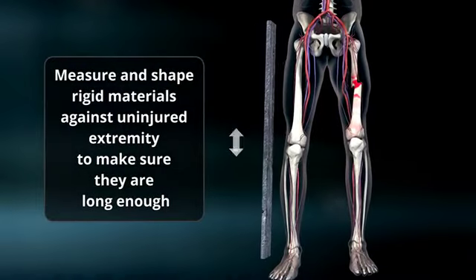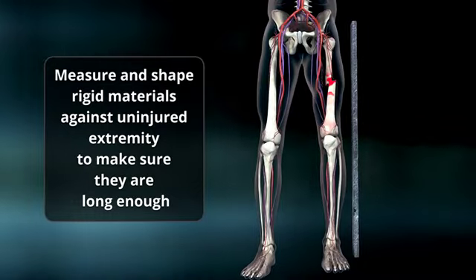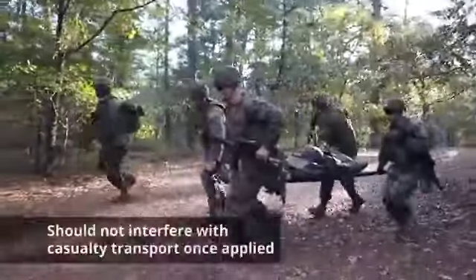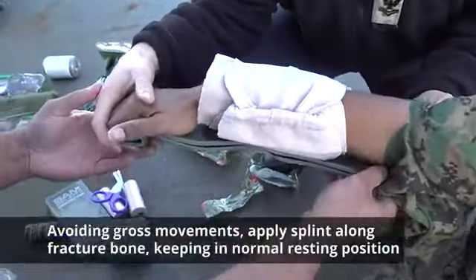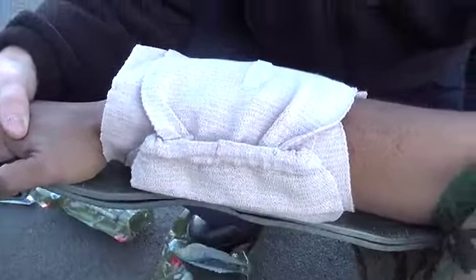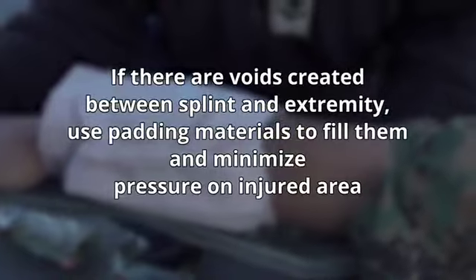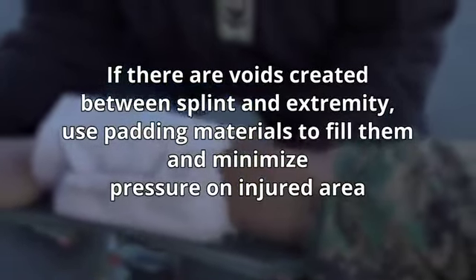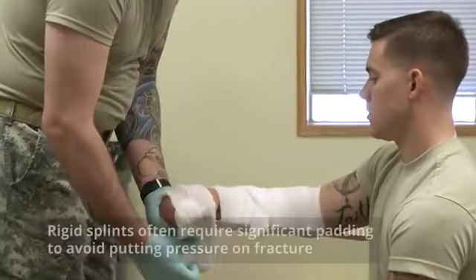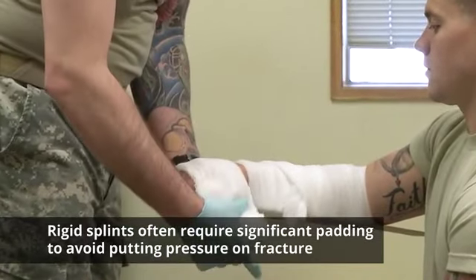If a malleable splint isn't available, then measure and shape rigid materials against the uninjured extremity to make sure they are long enough, but not so long that they will interfere with casualty transport once applied. Avoiding gross movements, apply the splint along the fractured bone, keeping it in a normal resting position. If there are voids created between the splint and the extremity, use padding materials to fill them and minimize the pressure on the injured area. This is particularly true for rigid splints, which often require significant padding to avoid putting pressure on the fracture.